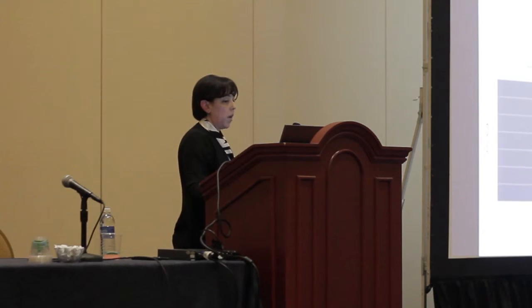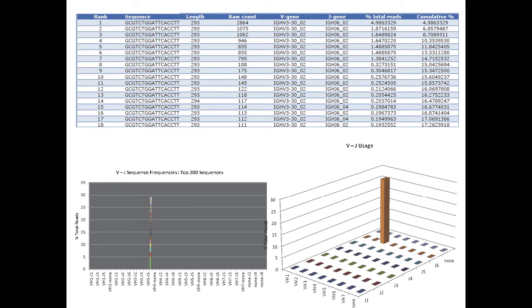So this is what we actually see. What we see here is that these are the clones, and all of the clones are exactly the same size, but they're not exactly the same clone. Each individual population here is 1 or 2 bases apart. So even though you have exactly the same fragment, you have multiple populations that are related. We interpreted this as mantle cell lymphoma, leukemic phase with CNS involvement, and this is suggestive of clonal evolution.